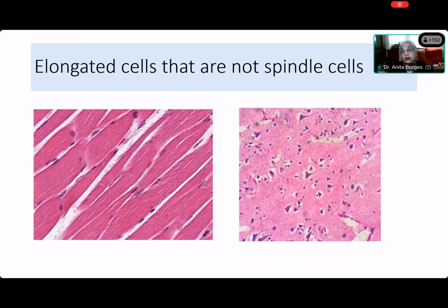Now, there are elongated cells, and they might have spindle nuclei, but they are not spindle cells. Now, Shashank, can you tell me why? What have I shown you on the left-hand side here? Can you diagnose what those cells are? They are striated muscle, ma'am. Very good. Do they have spindle nuclei? Yes, ma'am, they do.